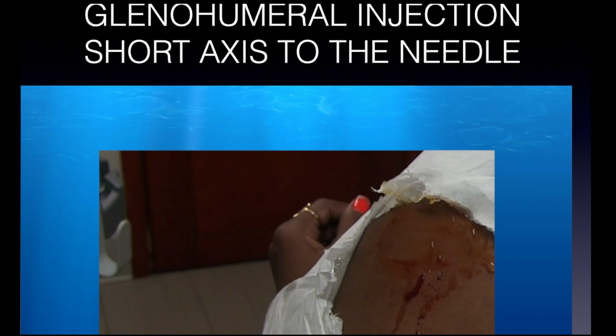So the advantage of this procedure versus doing an in-plane approach is that it's a shorter needle, it's a direct approach, and if you get it right, it might be a little bit less painful for the patient, because you don't have to traverse much territory in order to get to the target. All right.